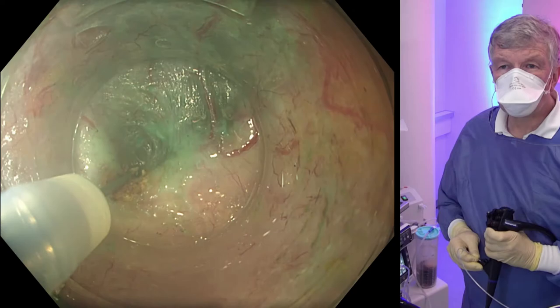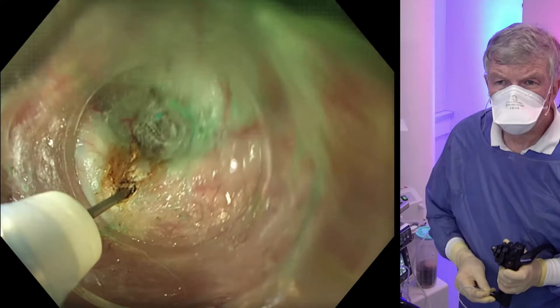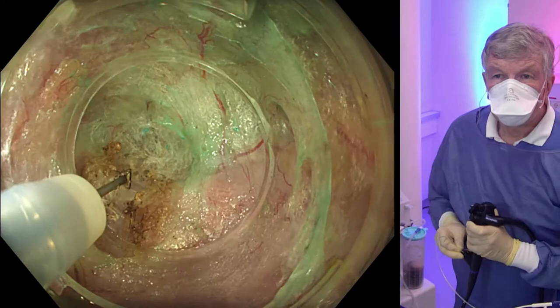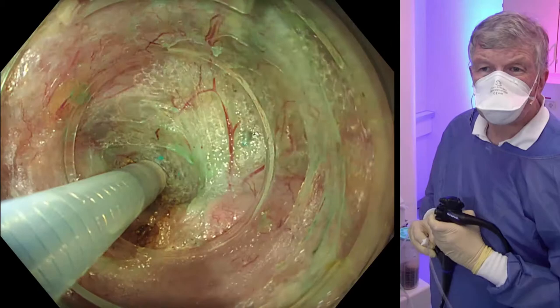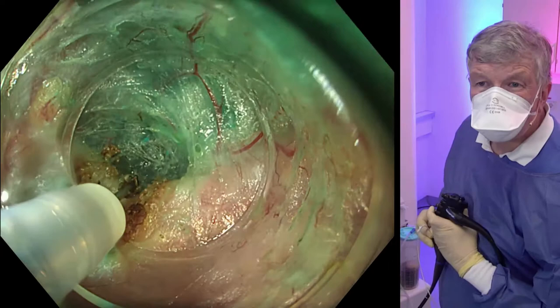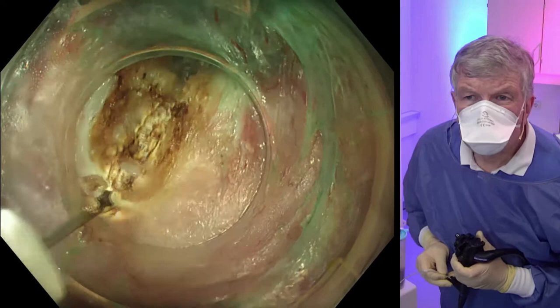We are using a swift coag, a special setting of the Erbe company. We wait for the motility to relax, not too deeply at the beginning, but layer by layer. Here we get deeper and deeper, with circular muscle still to be seen. We ask to get a little bit more space and separate the muscle. Here is the most distal part. We pull back and continue the cut, layer by layer again.